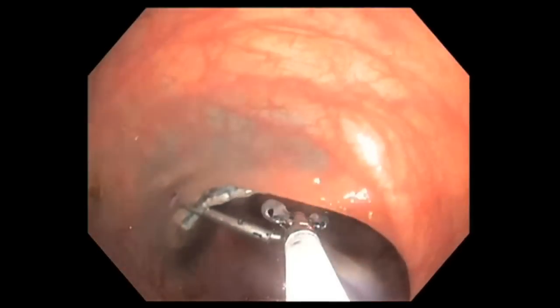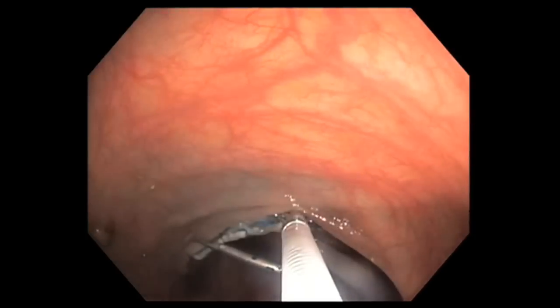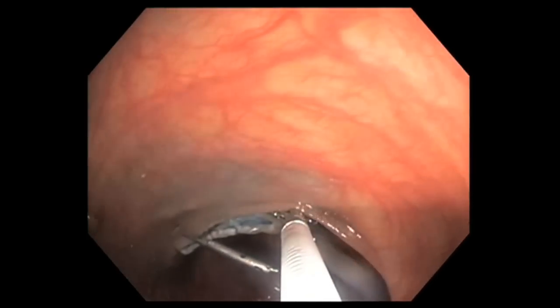After I've made sure that the polyp is removed, I clip the defect closed. Boston Scientific makes a very good clip — a device that will allow me to close this defect.